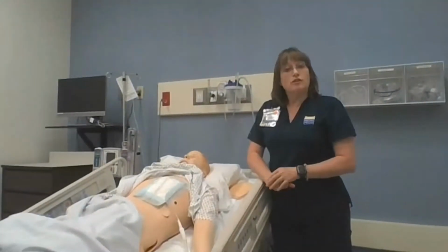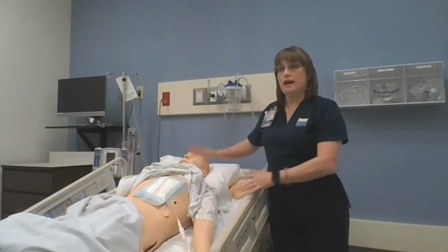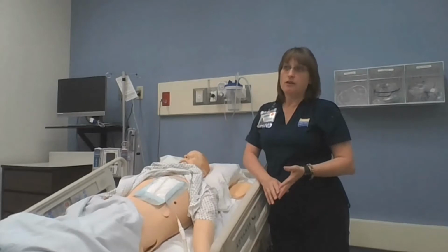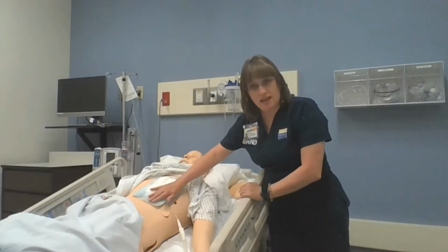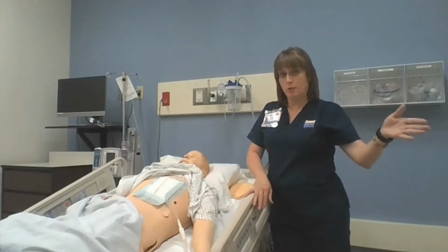You can have that during insertion. It can actually happen during the chest tube insertion. So if the chest tube was just placed in the OR or the ER, you'd want to know, palpate, and examine that. So you'd be like, oh, okay, that was there from insertion. So you can pass that on and report.